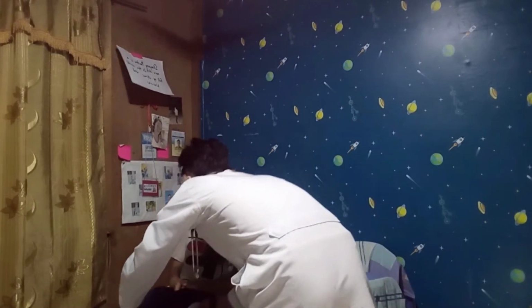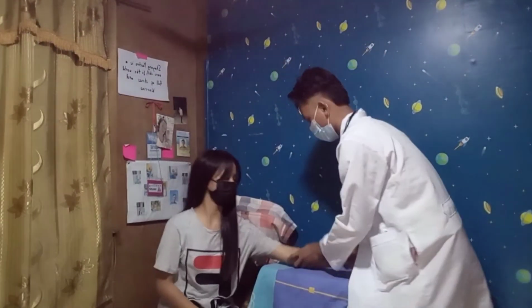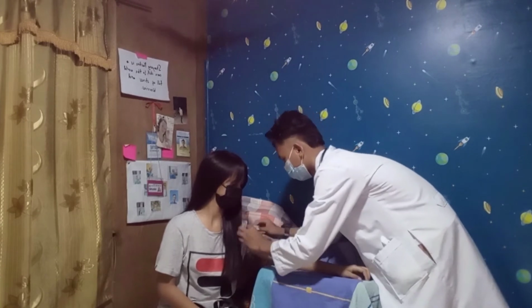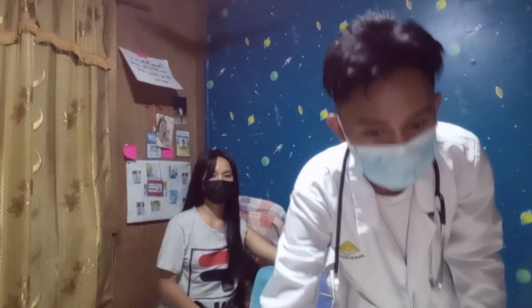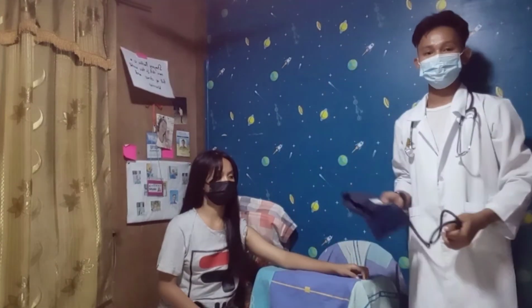First, you need to position the client appropriately and allow 10 to 15 minutes rest if the patient was engaged in a strenuous activity before the BP assessment. Fold the patient's shirt, sleeves, or gown up to the shoulders, making sure it is secured and will not fall over the brachial area. Ask the patient not to speak when BP is being measured.